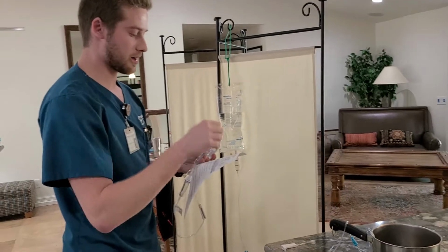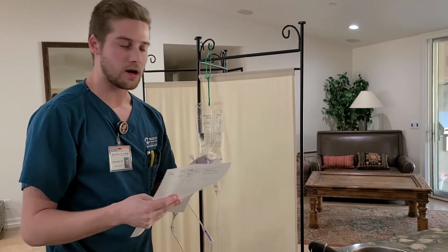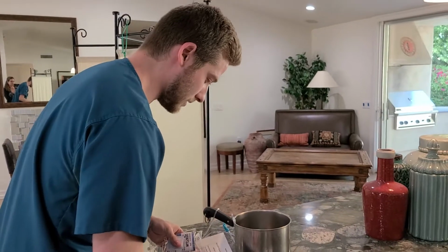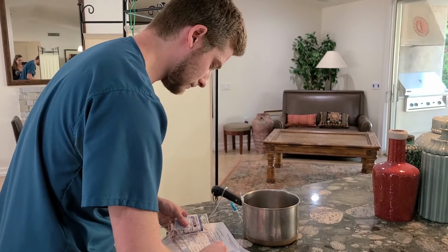Okay, knock, knock, knock. Hi, I'm Alex. I am your student nurse here today. I'm here to give you your antibiotic. Is it okay if I verify your name and date of birth here? Yes. What is your name? Lotta Fallings. Okay, I see that on our MAR as well. What is your date of birth? 10-5XX. Perfect, we have that.